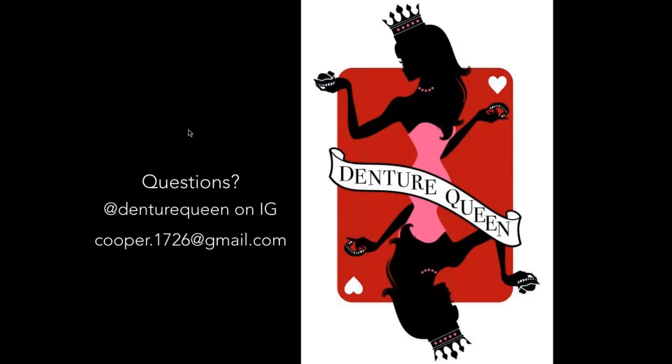Form 2 printer. Do I use that printer in the process at all? I do not use my Form 2 printer for this. However, there are ways you could use it. So I know that some doctors would like to print reference dentures, or you can scan a patient's own denture and then print it. That way you have a really nice reference denture to use with the digital process. You could do that.